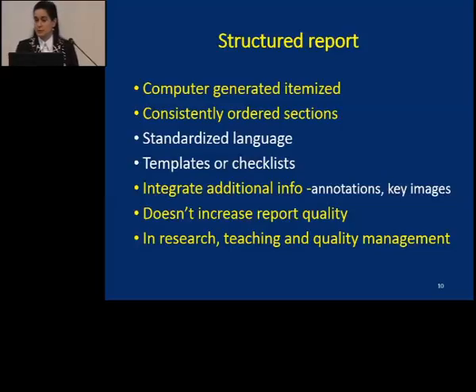So what is the structured report? This is computer-generated itemized reporting, which has consistently ordered sections and uses standardized language, and we have to have templates or a checklist to generate this report.